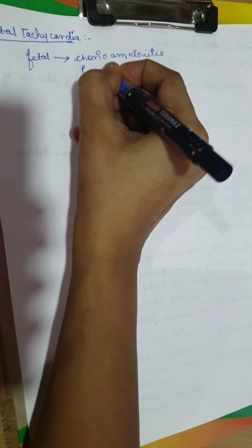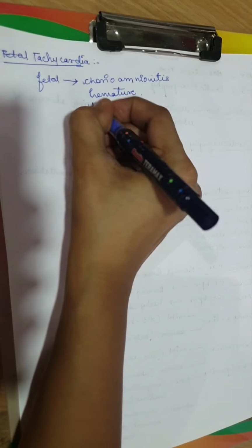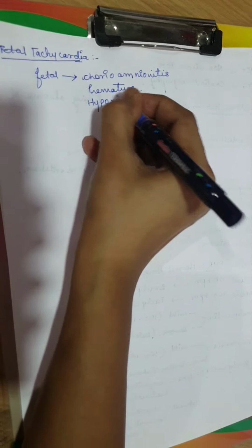If the baby is premature, there is no stability in the autonomic nervous system of the fetus, and this might also lead to a difference in the fetal heart rate. The main reason is if the fetus is in a hypoxic condition.